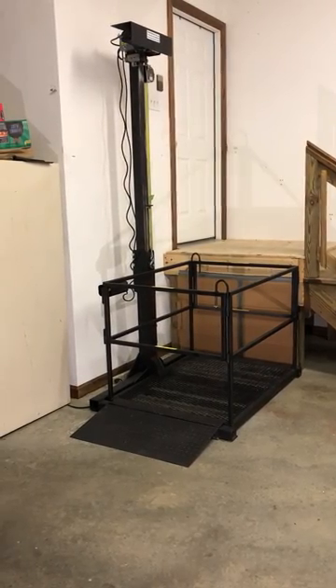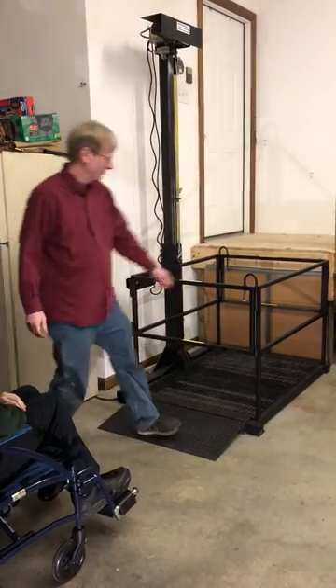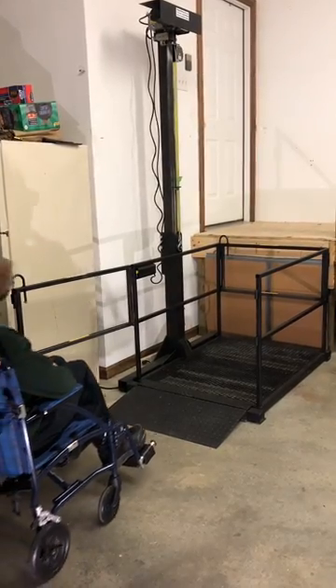Here's a demonstration of how to use the lift. First off, you get the door open before you get too close to it. And then you move the rider into the lift.